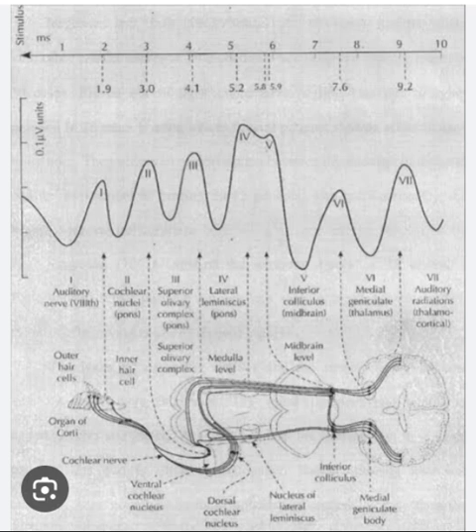history. Stimulus types. BERAs can be elicited using various types of auditory stimuli, such as clicks, tone bursts, or speech stimuli. Understanding the characteristics of the stimulus used in the test is crucial because it can affect the waveform morphology and latency values. The choice of stimulus should be appropriate for the specific clinical or research objective.